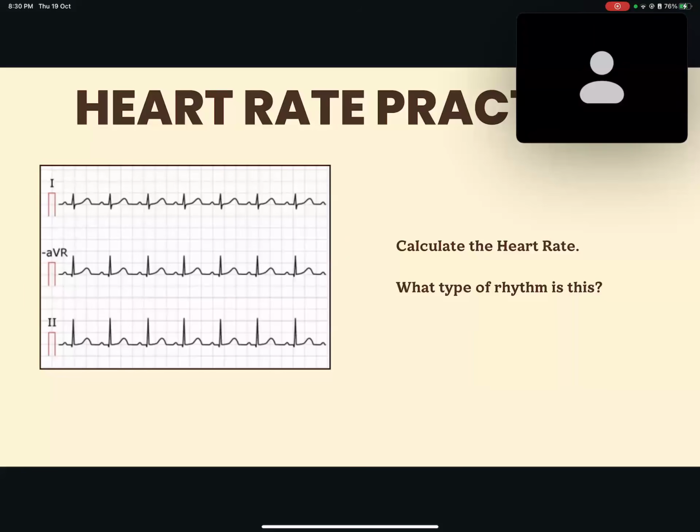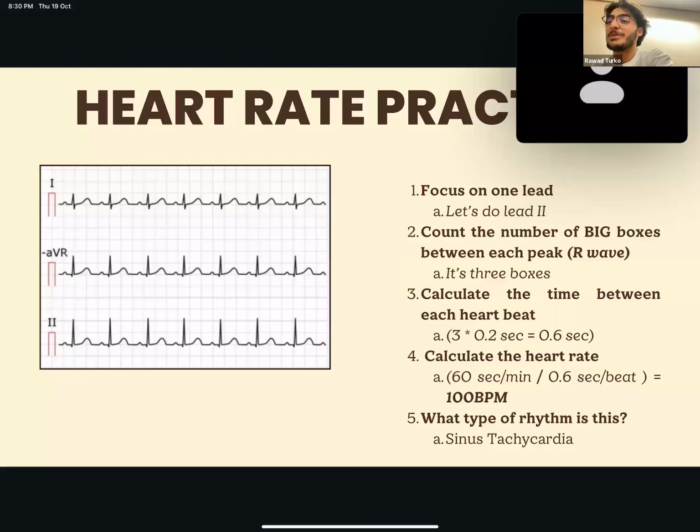Actually, I think I'm done. Okay. Can you tell me? Let me just check really quick. It's 100 beats per minute. 100? Yes, 3 big boxes. Yes, perfect. It is 100 beats per minute.